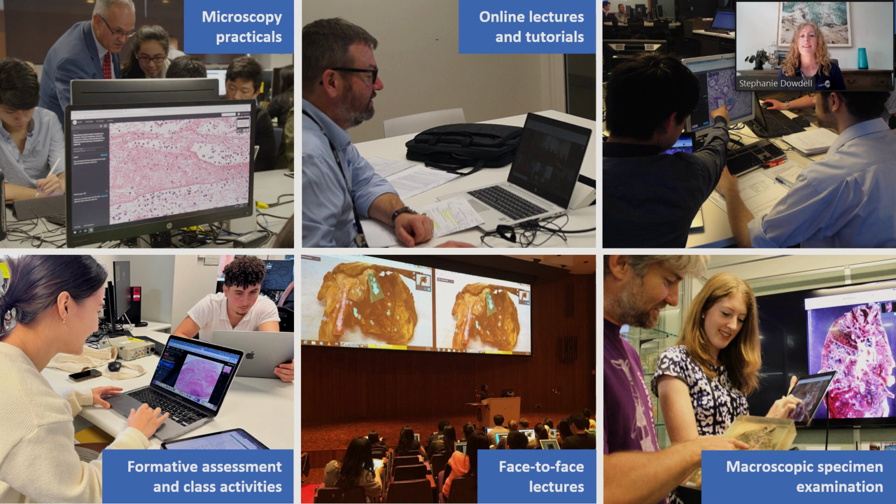So now let's take a look at the types of ways that SLICE is used in classes. I'd say that the most common use is in microscopy practicals or tutorial sessions. Some of our institutions have completely replaced teaching with microscopes with SLICE, while others use SLICE as a complement to their physical microscope sessions, allowing students to view the same slides outside of class. In the case of face-to-face sessions using SLICE, teachers or tutors bring up a virtual slide on the main screen and walk through the slide for the students.